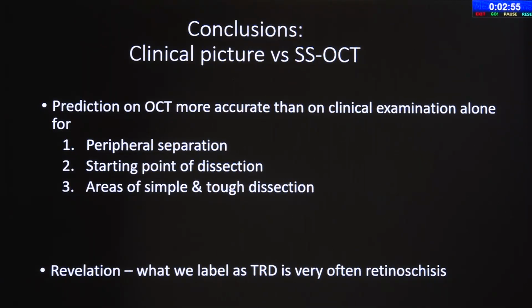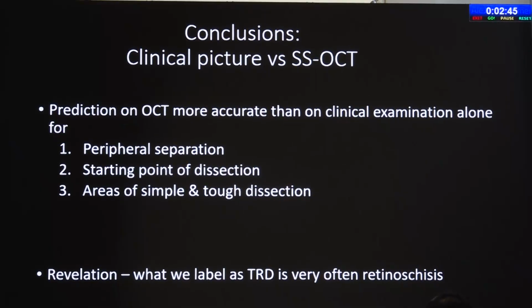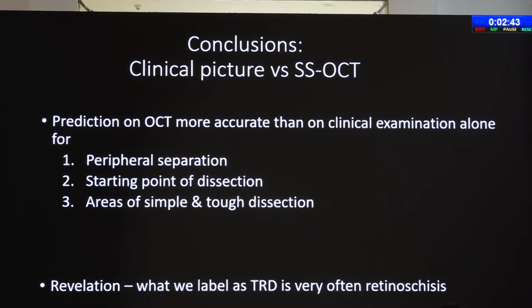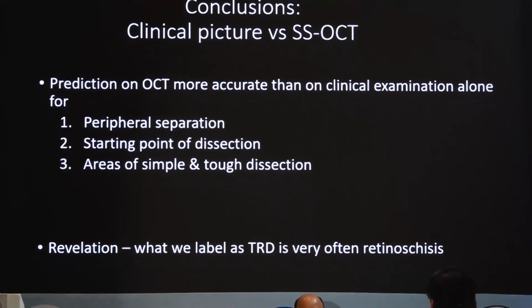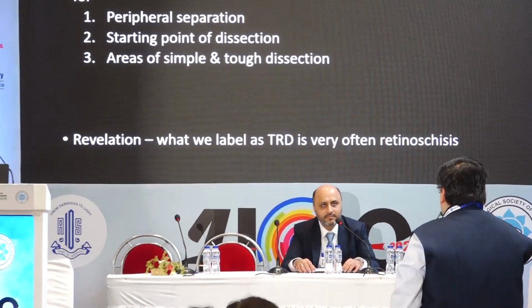Yeah. Dr. Ritesh. Since you mentioned intraoperative OCT, we tried to study preoperative and intraoperative OCTs where we had good visualization. Most of our pre-op OCTs were able to pick up the findings that we wanted to know. One very useful point was picking up sometimes a hole under a TRD.